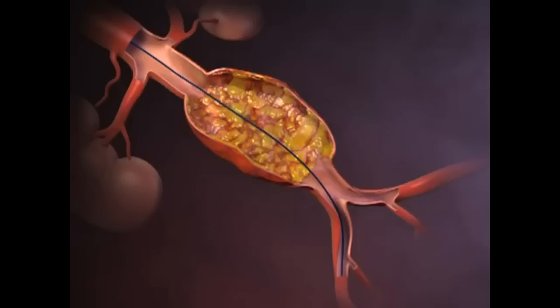This is followed by the sheathed main body of the stent graft, which is positioned with the use of fluoroscopy.